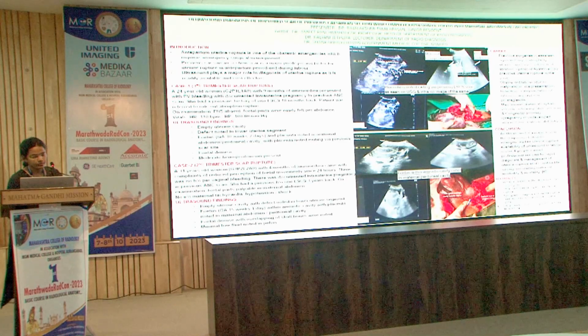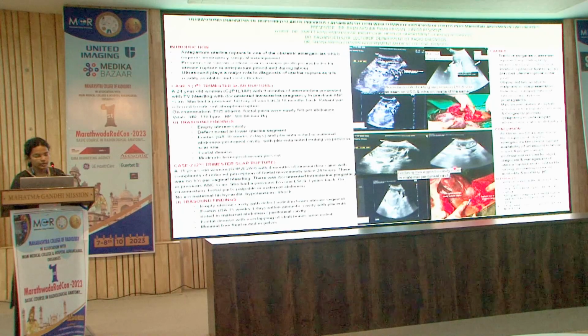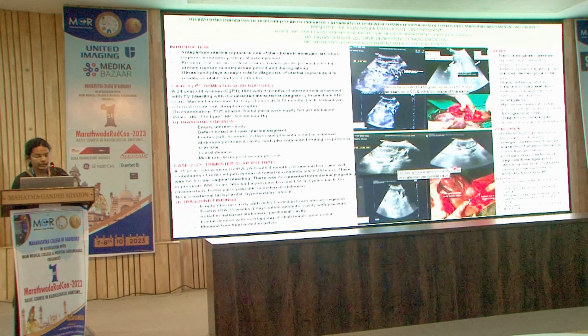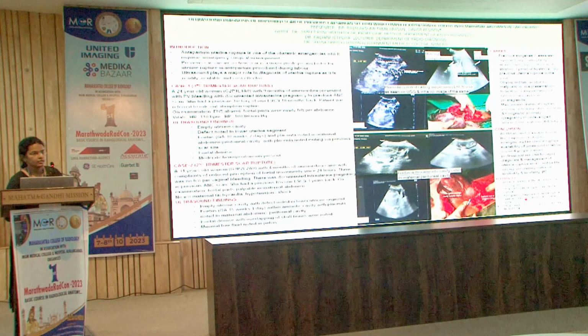So, conclusion: as ultrasound is a major tool in the diagnosis of obstetric emergencies like uterine rupture, availability of ultrasound in labor rooms and properly trained professionals are vital for rapid diagnosis and management of uterine rupture, as it is life-saving, preventing maternal morbidity and mortality. These are my references. Thank you.